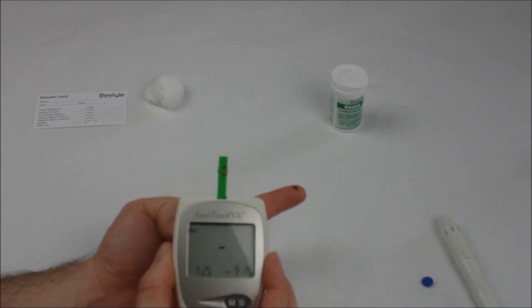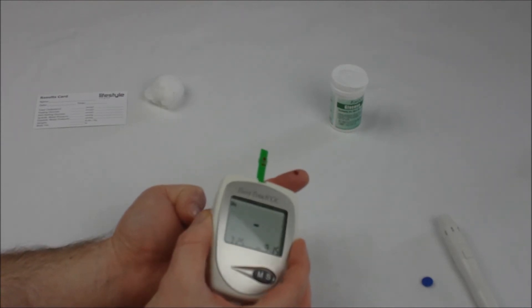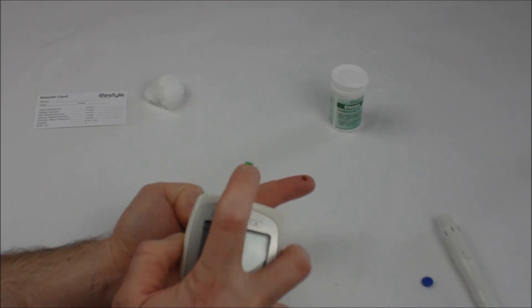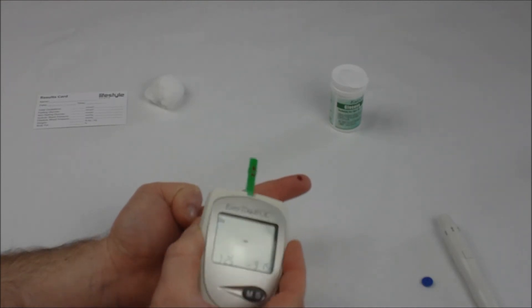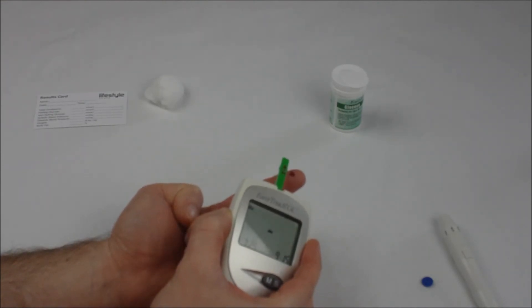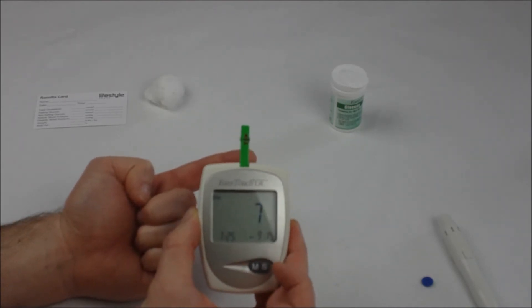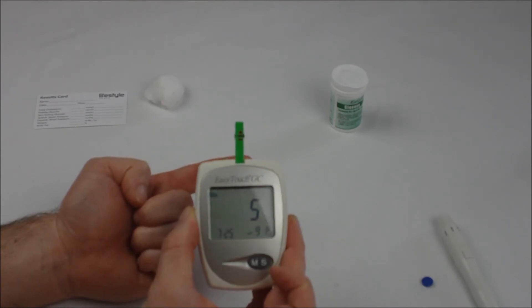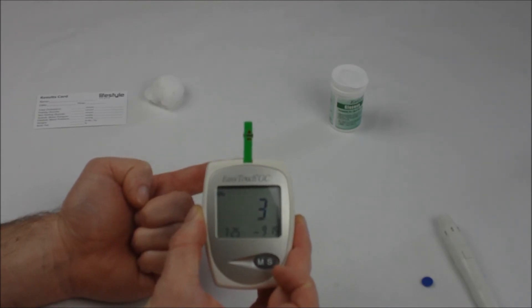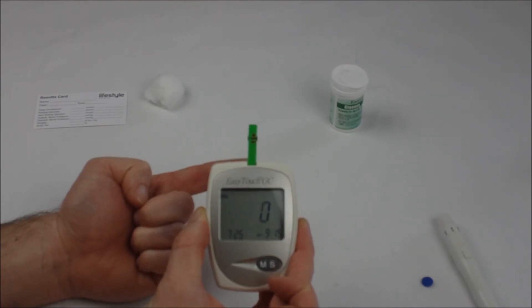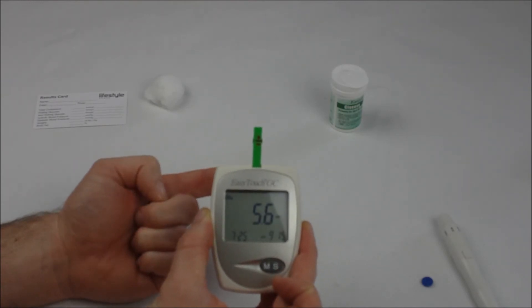Take your monitor and on the side of the test strip, not on the surface but on the side where the arrow is, you're just going to allow the blood to soak along the test strip area. As soon as it's soaked up enough, you'll see it count down from 10 and you should shortly receive a glucose measurement.